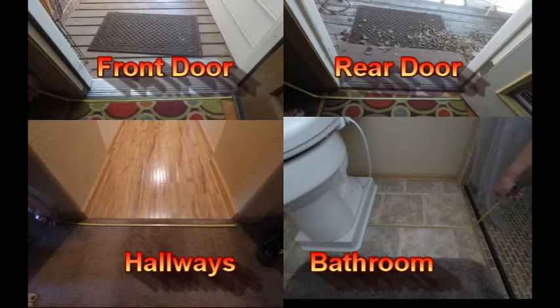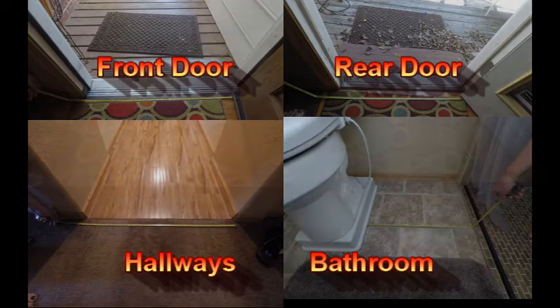Prior to selecting any power chair, you should also measure the door openings in your home to make sure that the width of the power chair you select does not exceed the width of the doors that you have to go through. If the doorway you are planning to go through includes a 90-degree turn, you will have to add some extra space to make the turn into that room.